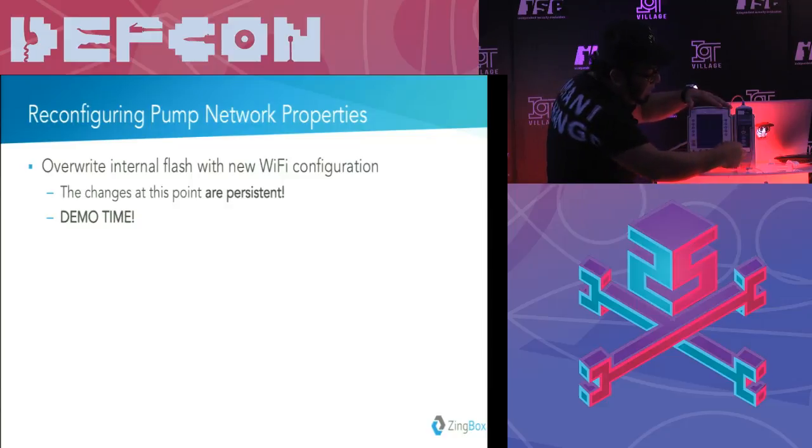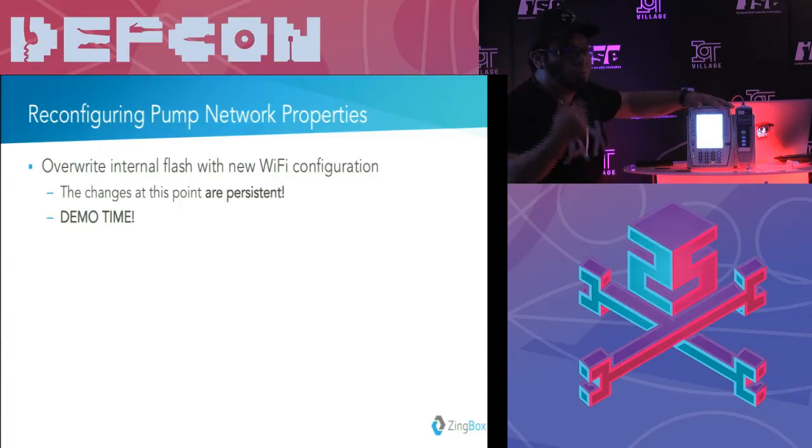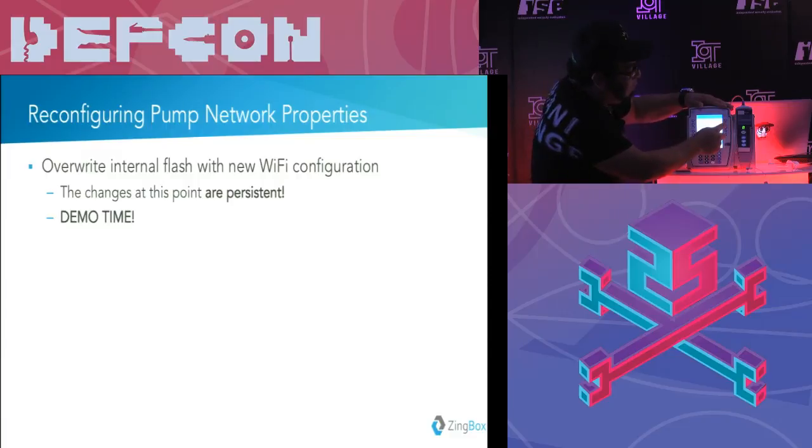So I'm going to turn this guy on, and then it's going to start booting up. During the boot-up process, it's going to replace the configuration file. Probably you don't see that at the beginning. If you remember, the SSID was default. So let's see now. It says new SSID, we go the same thing. Let me show you the Wi-Fi configuration.